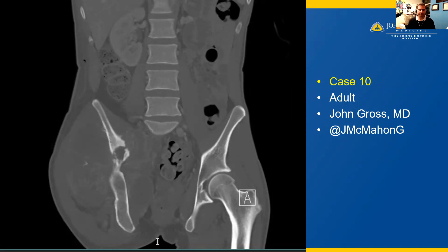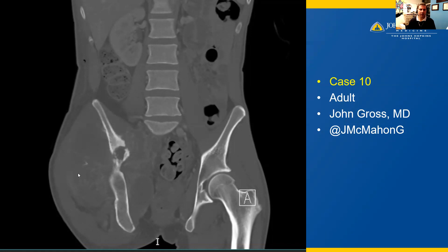Here we have case number 10 from an adult. We have a CT scan in the coronal view in the bone window. Here we have a destructive mass on the right pelvis. This mass is growing both laterally and medially to the iliac bone, growing through the bone and out into the soft tissues. If you look very carefully, you'll see a little focus of matrix mineralization that we can appreciate here on the bone window of this CT scan. So we have this large destructive mass, but we have a little bit of matrix mineralization here, which is a clue for us.